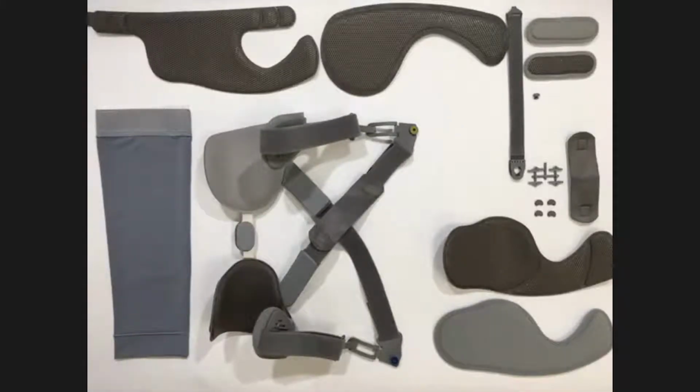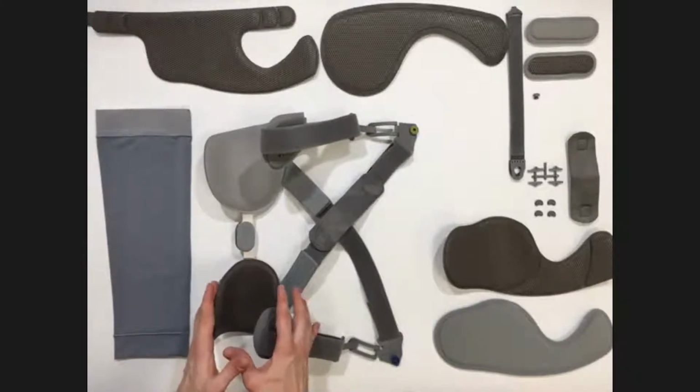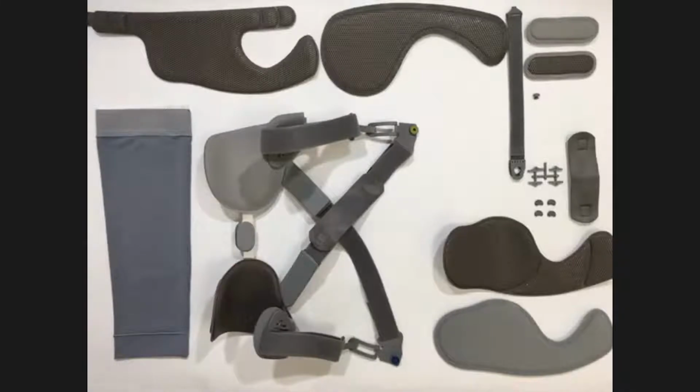So the reason for this is we're anchoring this on the calf, holding that in position, and the thigh section is normally a little bit looser, so it allows it just to shift and really anchor in position over the gastroc. The top of the gastroc is really the main area where we can anchor a brace, so it's important that we have those. You can also see that we've got a popliteal pad, and it does come with a spare one of those included in the kit.